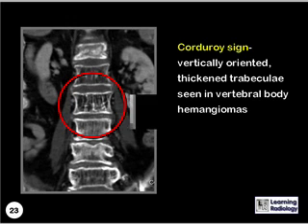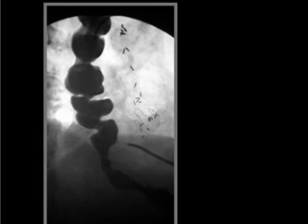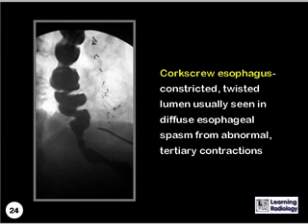What sign is demonstrated here? This is a corkscrew esophagus, which is the constricted, twisted lumen usually seen in diffuse esophageal spasm from abnormal tertiary contractions.